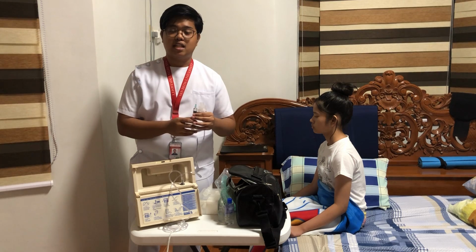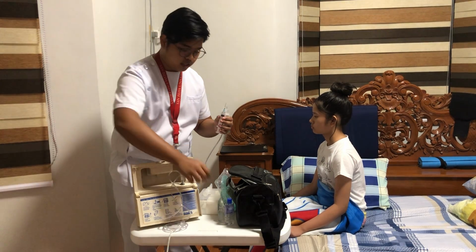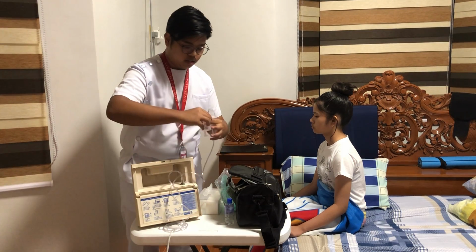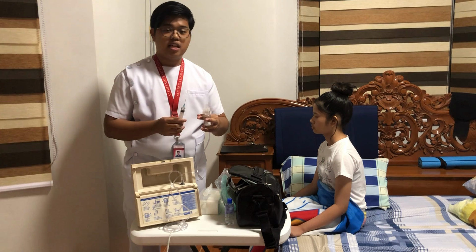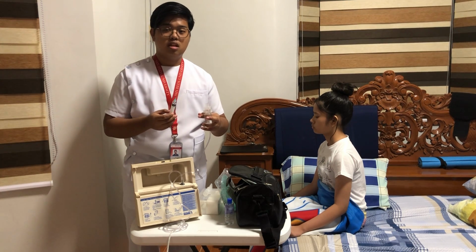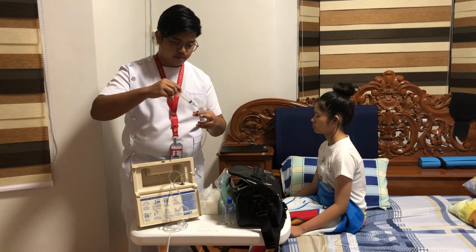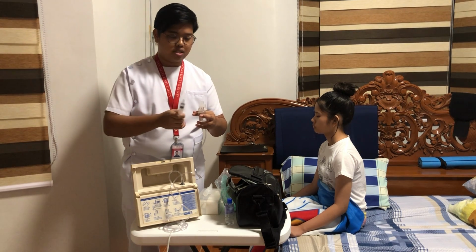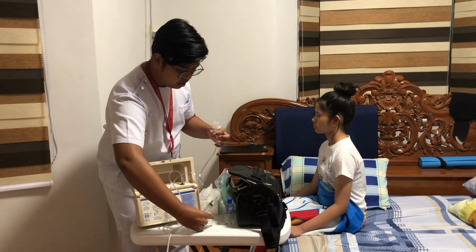And then we need to add a sterile normal saline solution or a sterile water. Especially when we are dealing with pediatric patients, but in cases that we're dealing with adults, we can give the whole nebule for the process of nebulization. So for demonstration processes, I will add a normal saline solution or a sterile water.